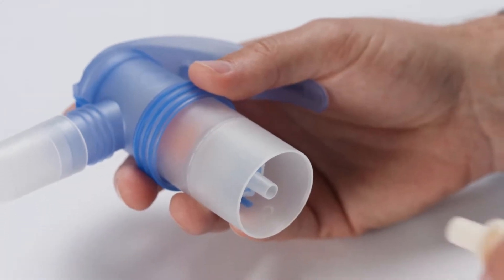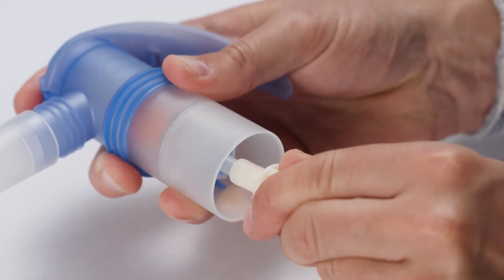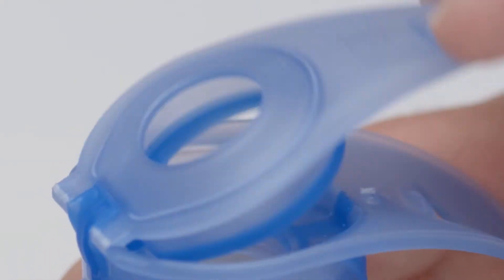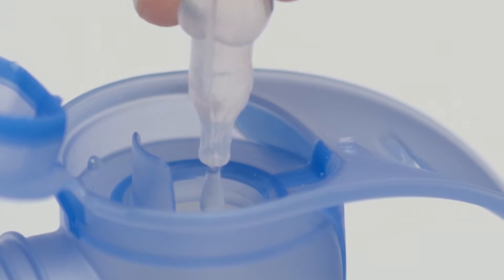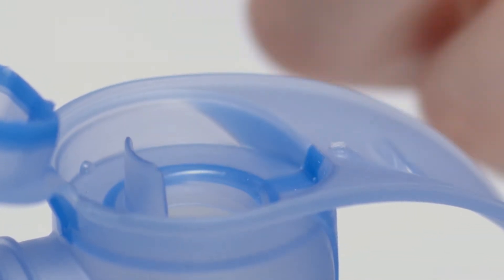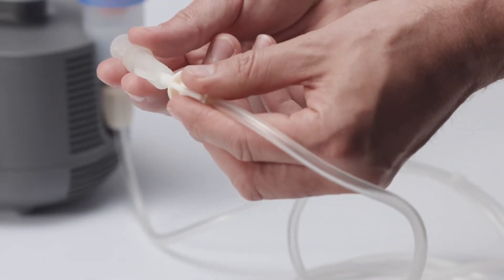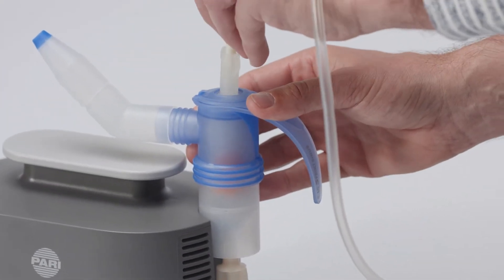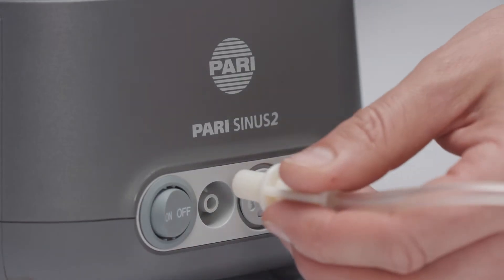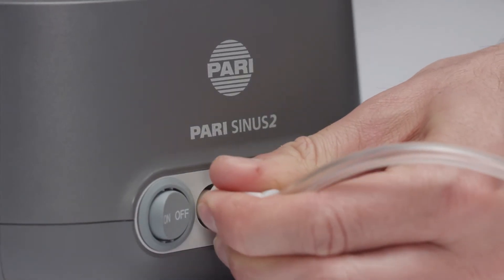Attach one end of one tube to the bottom of the nebulizer. You'll notice that only one end fits. Open the cap, add the inhalation solution and close the cap. Attach the fitting end of the second tube to the vibration connection on the top of the nebulizer. Connect the other ends of each tube to the fitting sockets on the compressor.